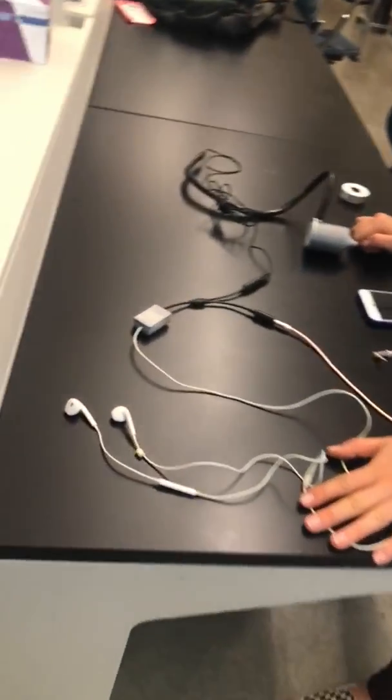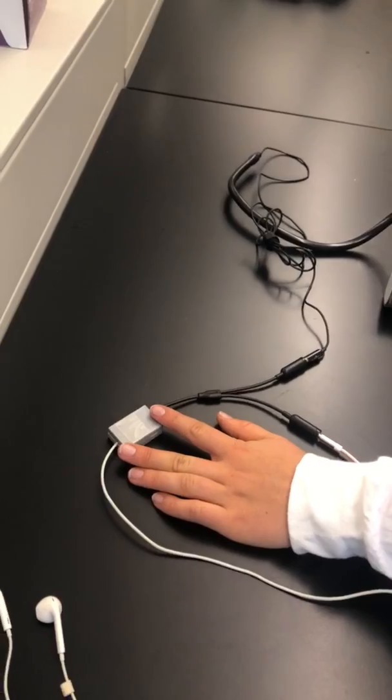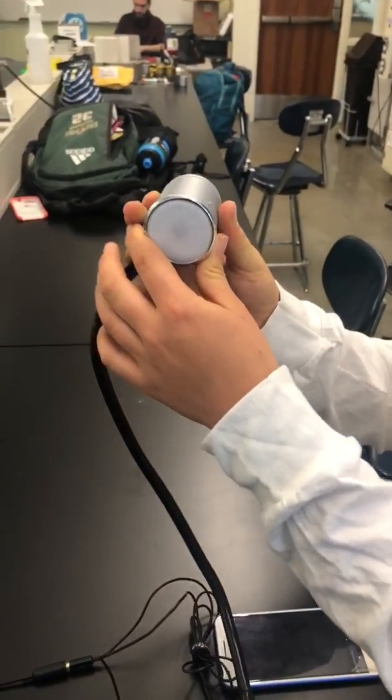This is the virtual stethoscope prototype for House Calls Mobile. It consists of headphones for the user, a filter box containing all filtering components, and the stethoscope head attached to an autoscope base.